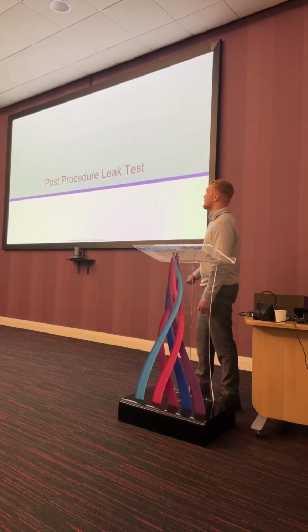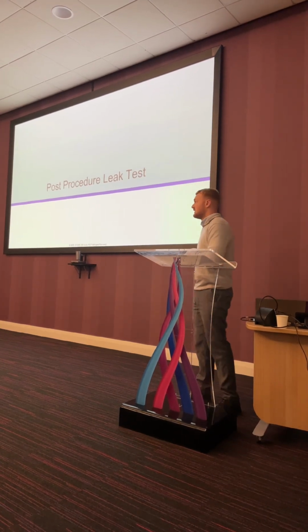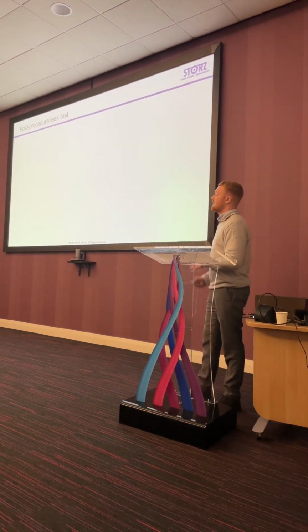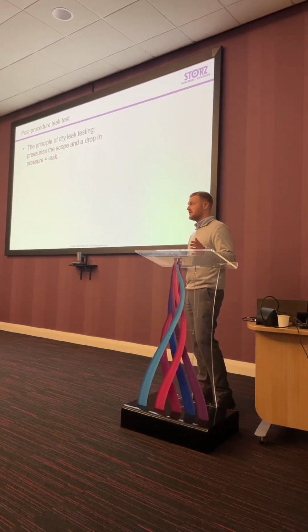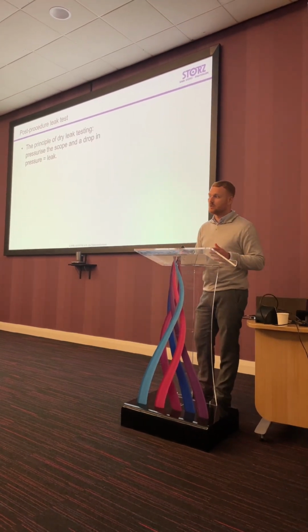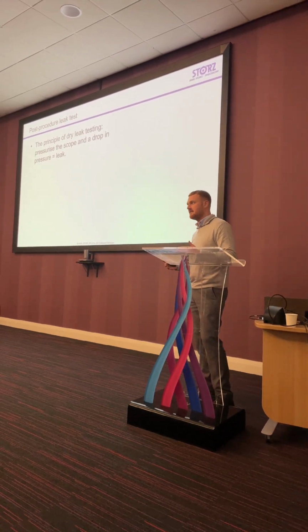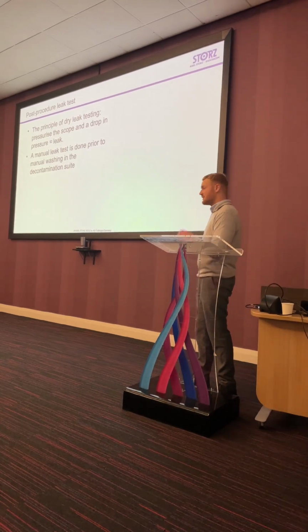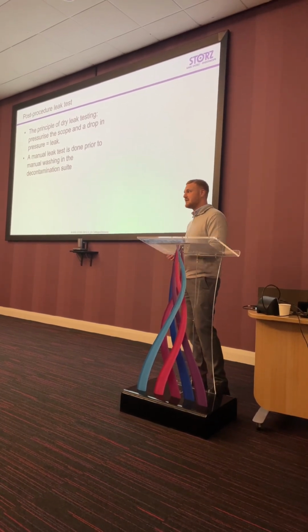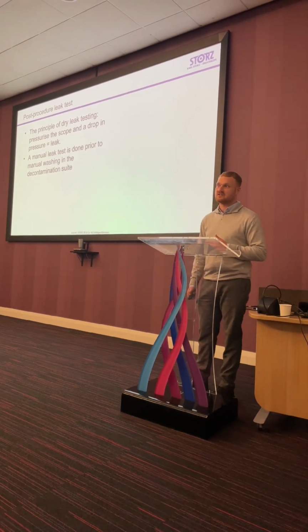So one way to know if your scope is leaking and to nip it in the bud as soon as possible, and this is something that will be done down in HSDU, but it's obviously routine practice to also be done following the procedure as a bedside clean. So I'd say one of the most important things to do when you go back to your department is making sure that your team are carrying this out before they're sent down to HSDU.